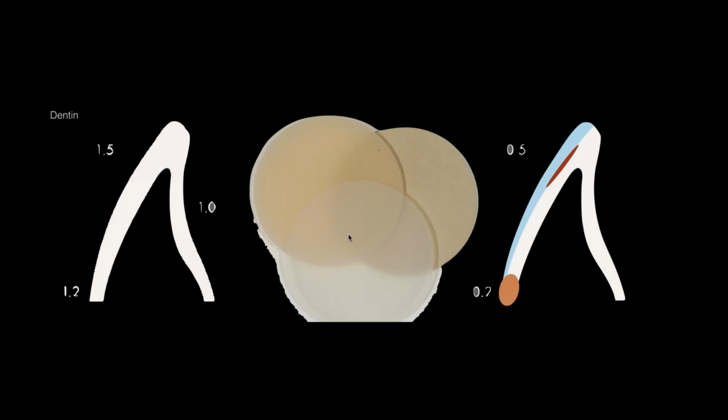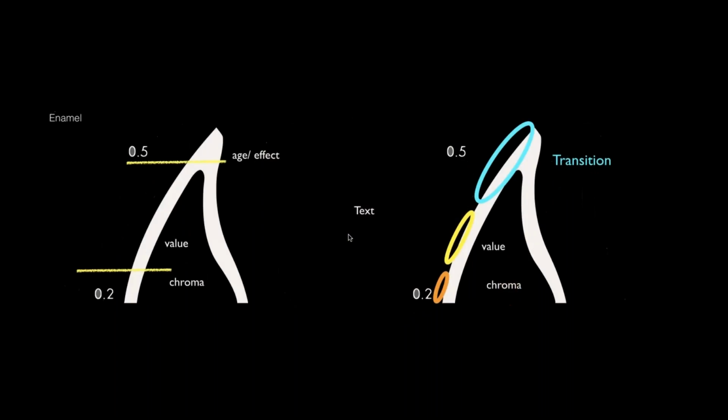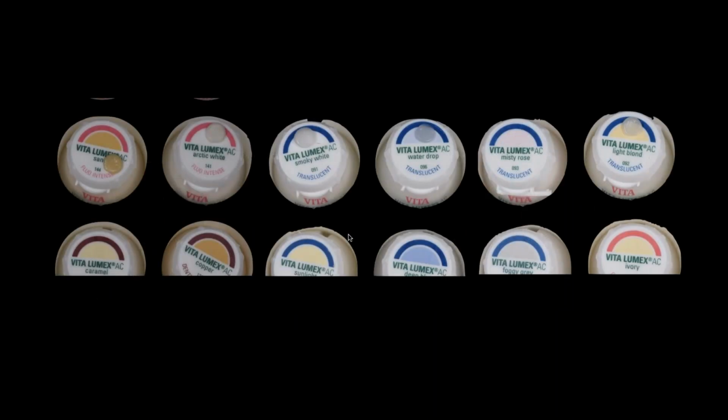Again, the flaw: how often do you have that exact same scenario to work in? And can you really get everything you need from two powders? I would argue no. You're going to need more. You're going to need other dentins to increase value, or other materials inside to lower value and get a little bit more chroma aspect in some of those areas. So I manage that space the same way, and I manage it by understanding the opacities and translucencies of the materials.